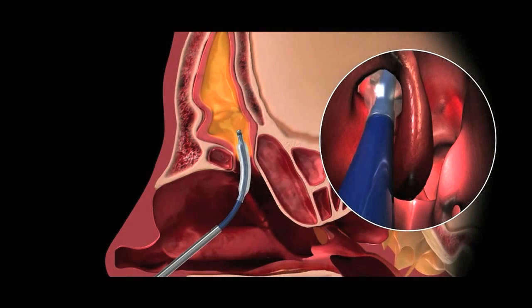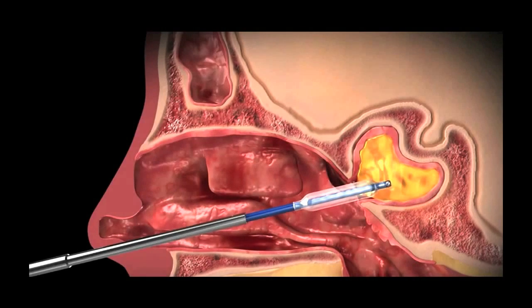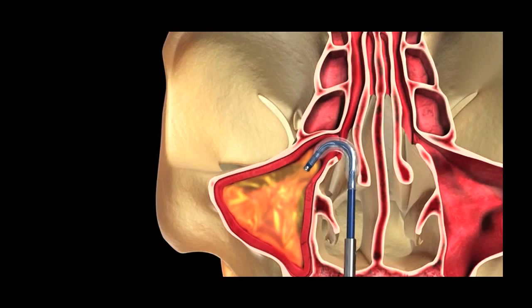It can be used on the frontal sinus, as we just saw, as well as the sphenoid sinus and the maxillary sinus.